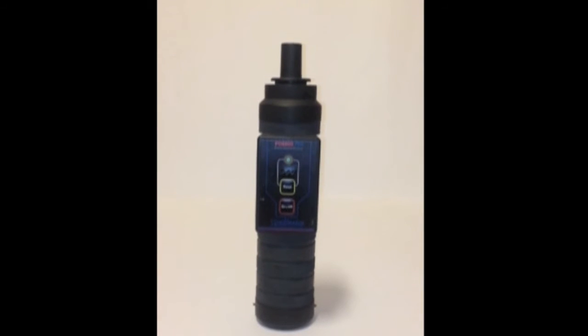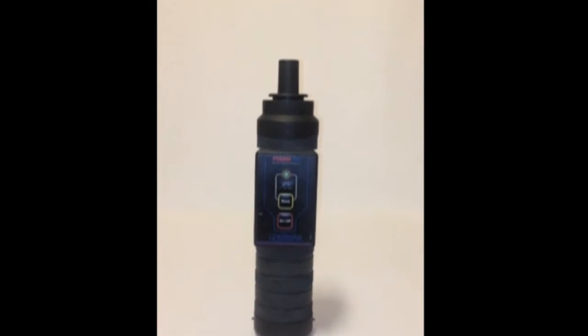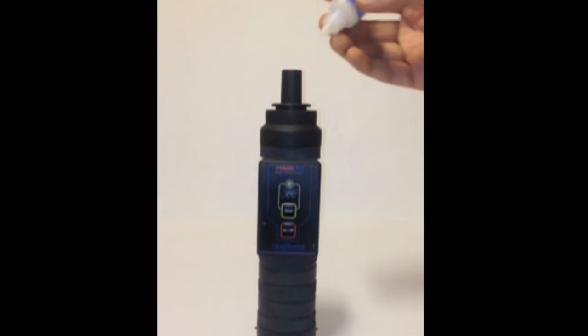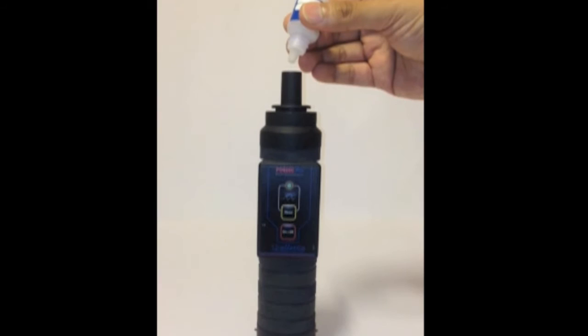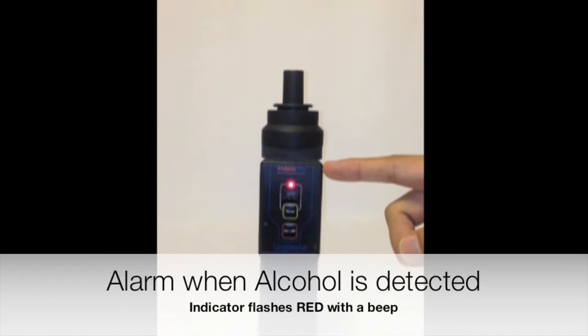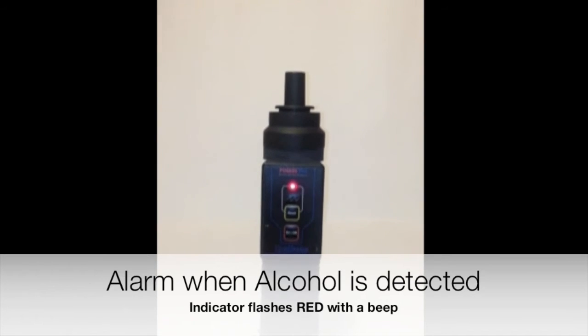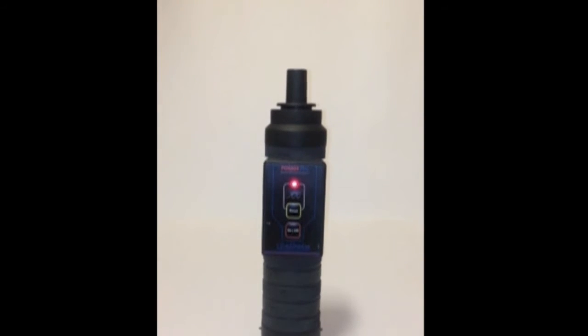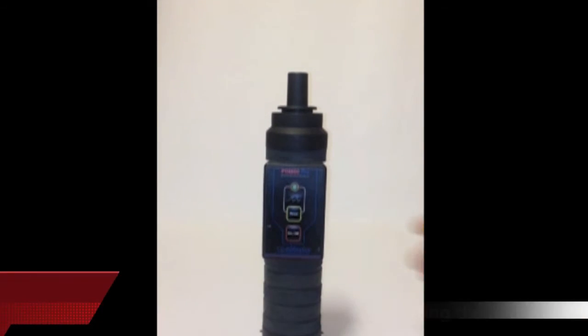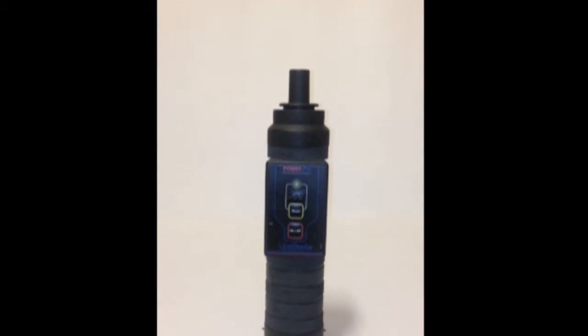In case there is an alarm or alcohol is detected — any traces of alcohol in the subject under test — the instrument would beep and the indicator turns red. We will show a demonstration using the test bottle. The indicator turns red and starts flashing along with the audio indication. To reset the instrument, simply press the reset switch, and the instrument will reset and start flashing green again, indicating it is ready for the next test.